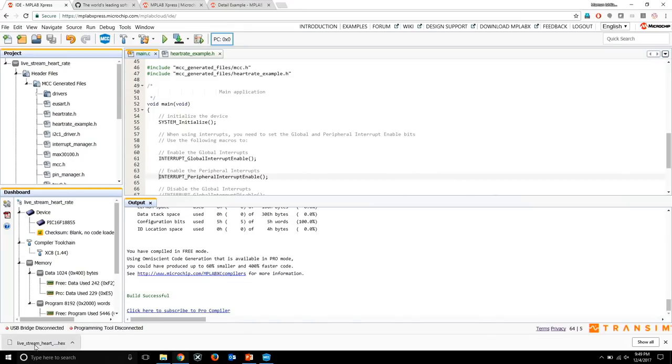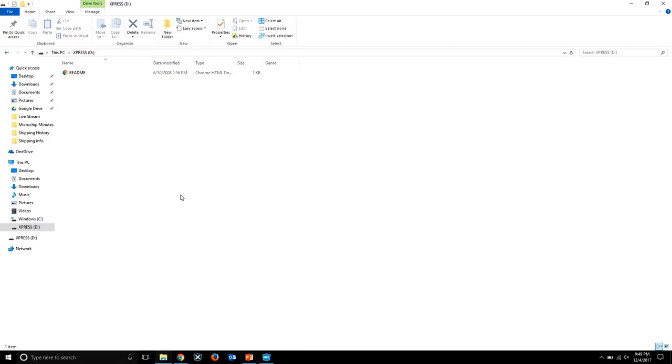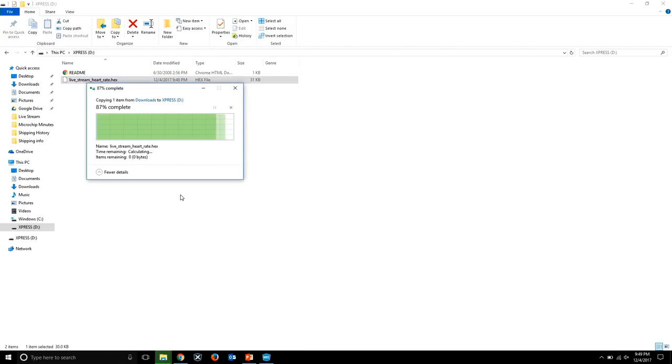And that's where you're going to drag and drop over. That's correct. I can drag and drop, I can copy and paste. It's up to you guys. And I'm just going to drag and drop and do this right there. It's going to take a second and boom. See that? Wow. Yeah, it's just that fast.